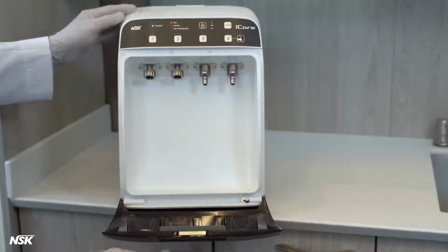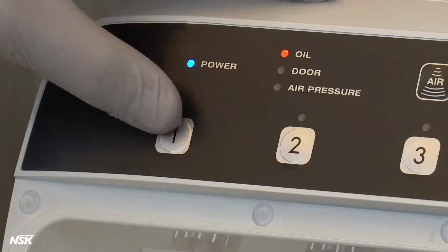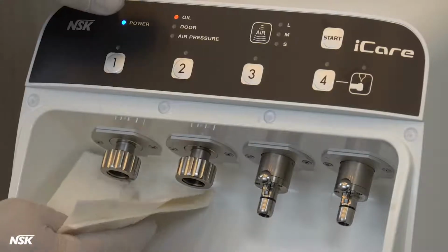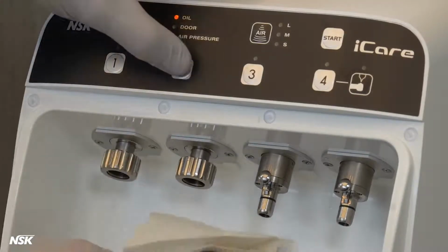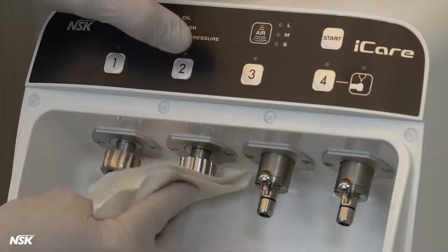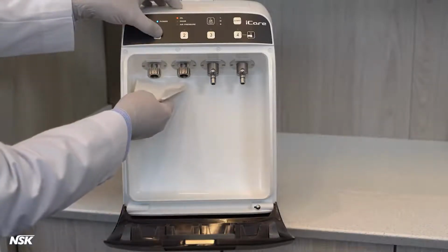Next, open the front door. To prime the ports, hold a paper towel under each port and press the port activation button until you see oil begin to flow through the port. This will take a few seconds for each port. Once you see oil, release the button. Repeat this process for all 4 ports. Start with port number 1 and work to the right.